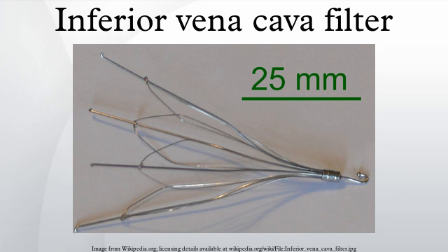It is important to note that the clinical exam prior to the removal of the filter is vital in understanding both the risk and pathophysiological effects removing the filter will have on the patient. Doctors and medical professionals must consider several key factors. History. The IVC filter was developed by Lazar Greenfield.